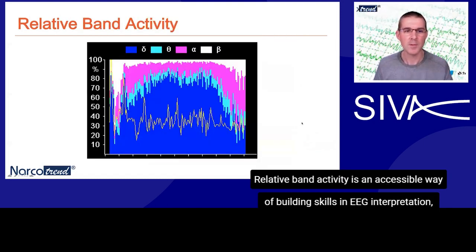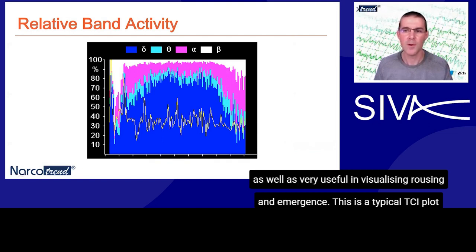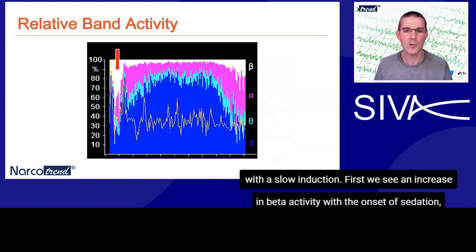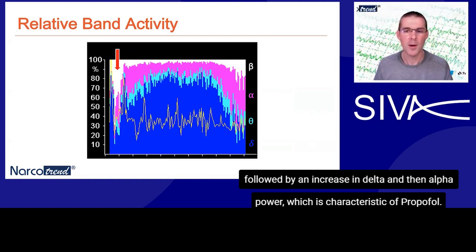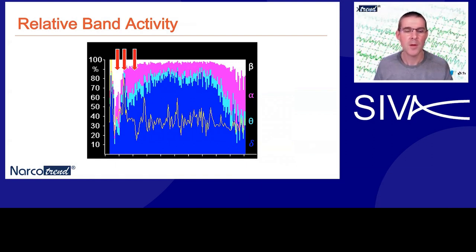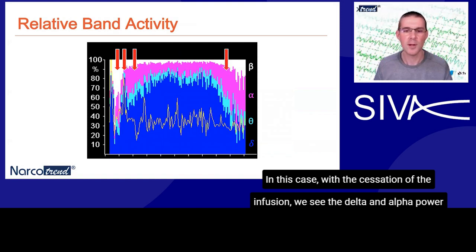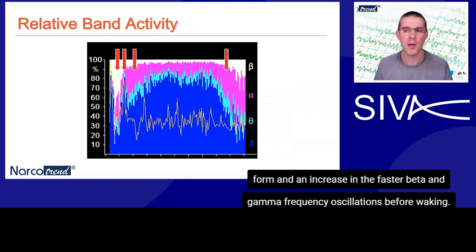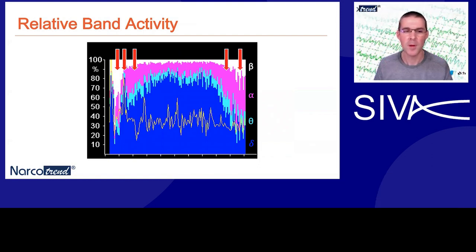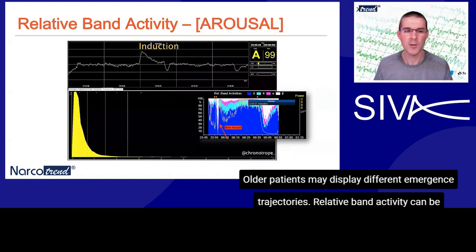Relative band activity is an accessible way of building skills in EEG interpretation, as well as very useful in visualising the induction and emergence. This is a typical TCI plot with a slow induction. First, we see an increase in beta activity with the onset of sedation, followed by an increase in delta and then alpha power, which is characteristic of propofol. In this case, with the cessation of the infusion, we see the delta and alpha power fall and an increase in the faster beta and gamma frequency oscillations before waking. Older patients may display different emergence trajectories.